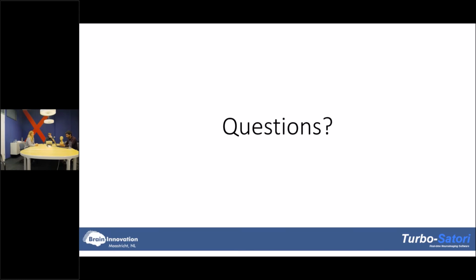From the registration time, we have one question, but not related to Turbo Satori. They are trying to learn features of Turbo Satori to make a purchase decision. I hope they know enough now, but if you need some more information, please write to us. We'll be happy to talk about it or tell you something more. From the chat, we don't have any questions, but we still have a few minutes. If you have any questions, you can type them in. We will be happy to discuss it.